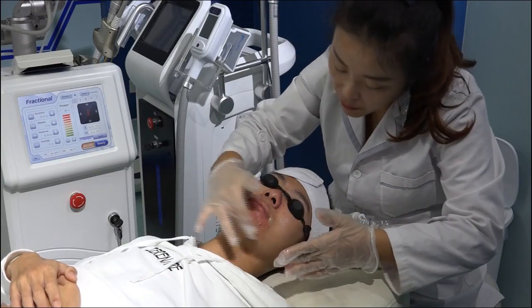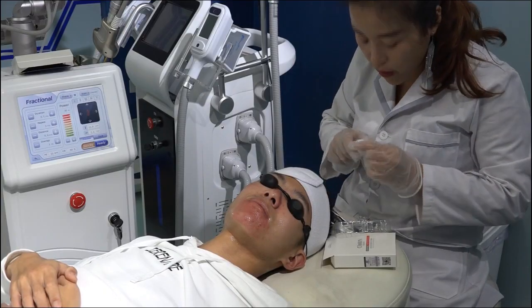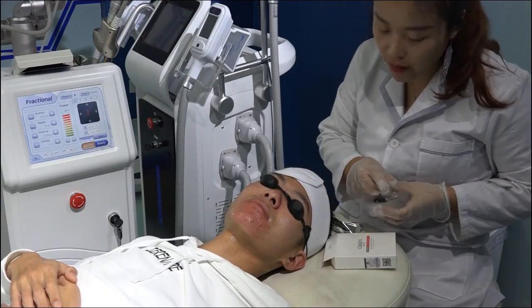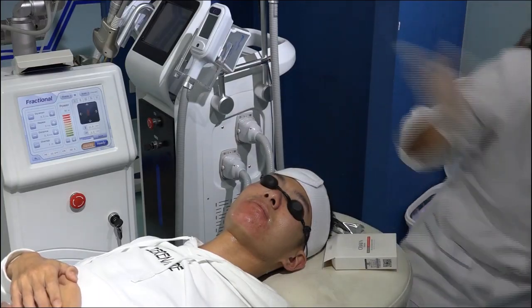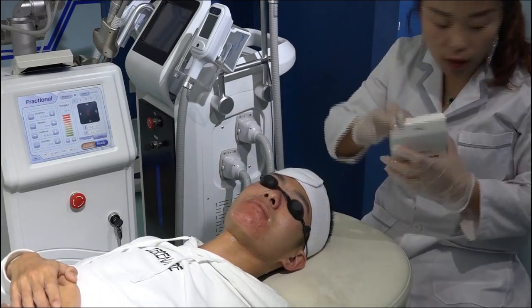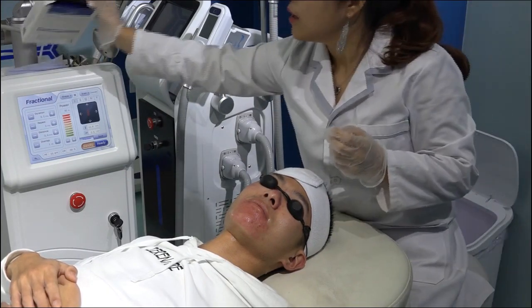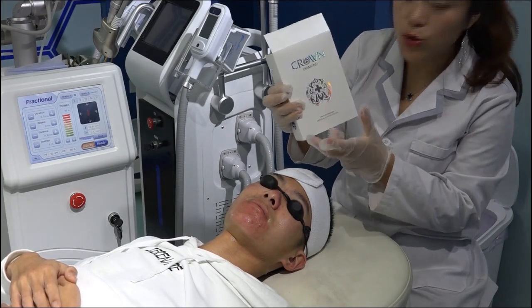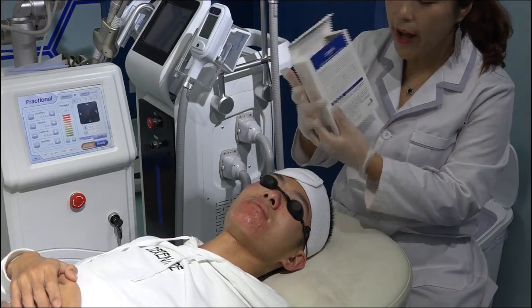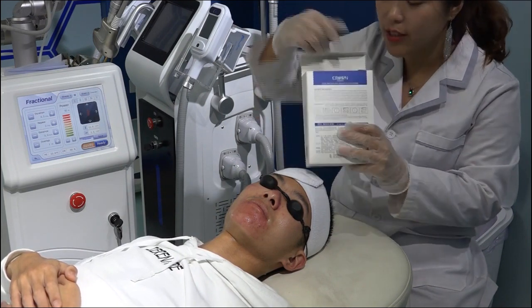Okay, after we apply this, we will apply a facial mask for hydrating. Because now the skin has CO2 laser heat, and also it needs water on the skin. You can use the medical hydrating facial mask for hydrating only, not for skin tightening or whitening, just hydrating.